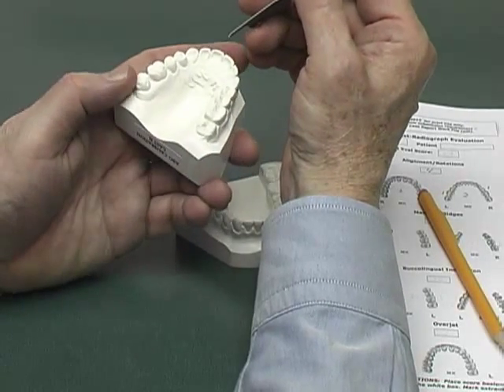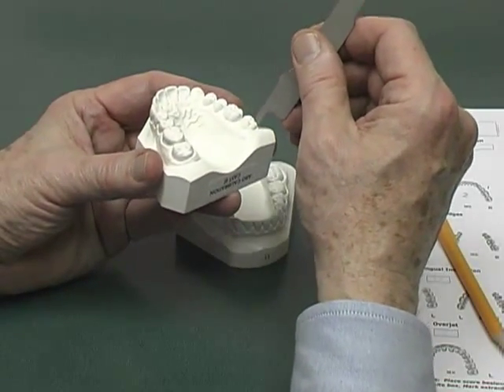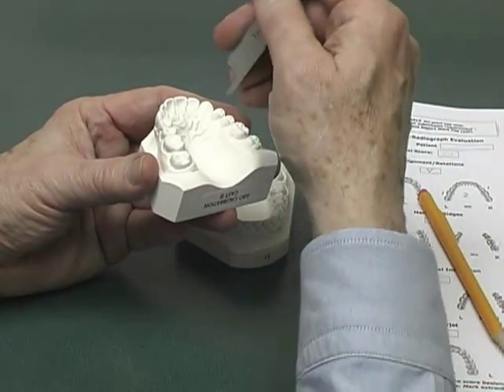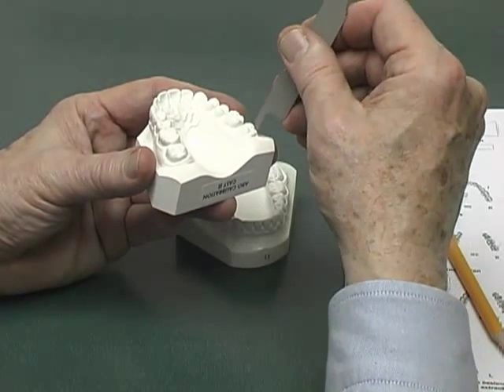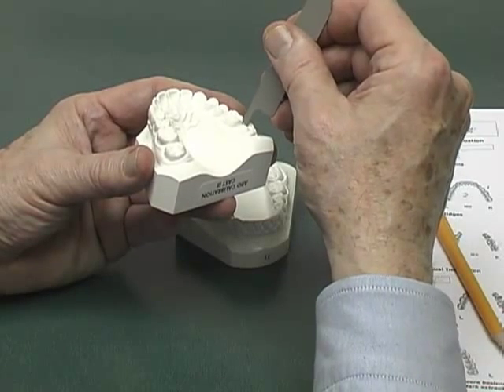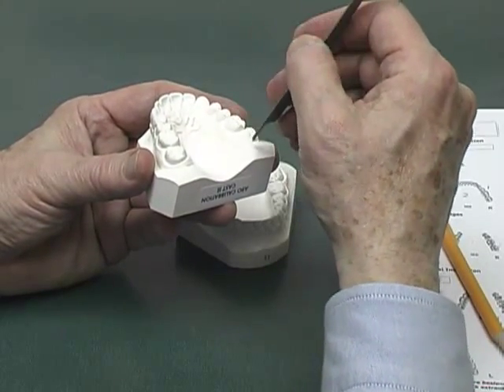Now I do the same thing to the left, with mesial-distal sweeps. And there is a definitive catch on the first molar that is less than 1 millimeter, so it scores at 1. Okay?